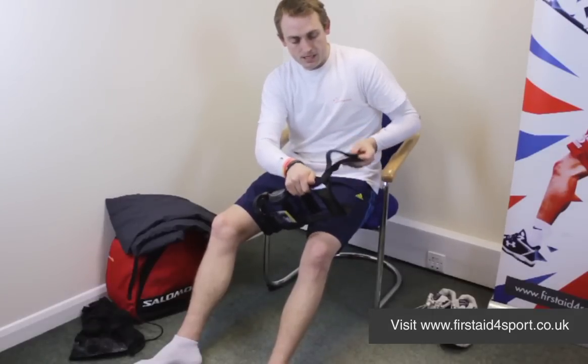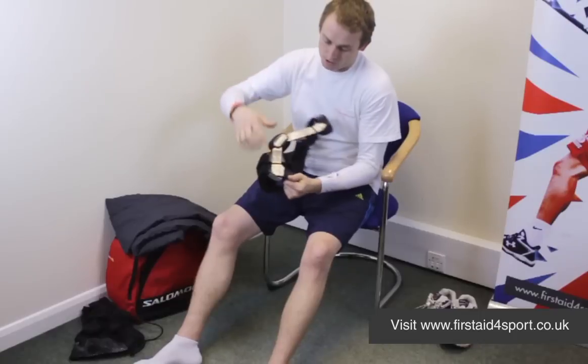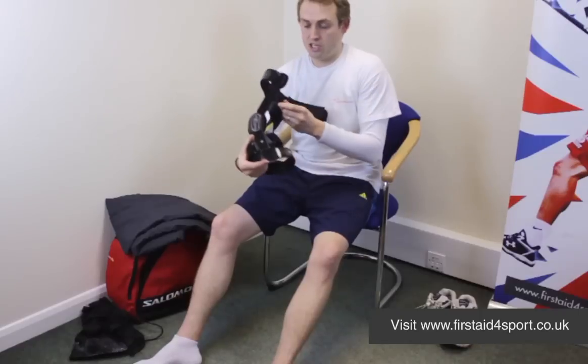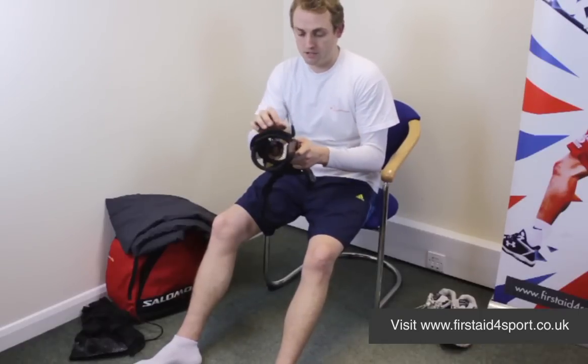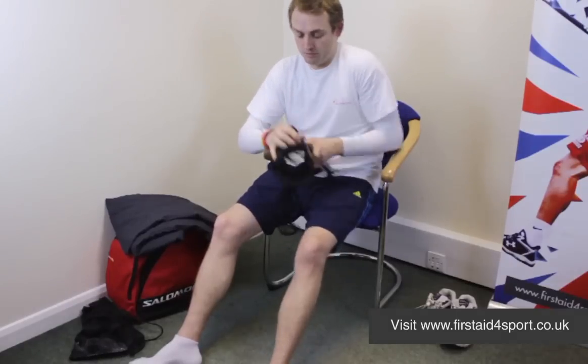They use Donjoy's numbering system on all the straps, and it's also a very short calf, so it can be worn with ski boots, motocross boots, and anything else that you need to wear when you're doing activities.